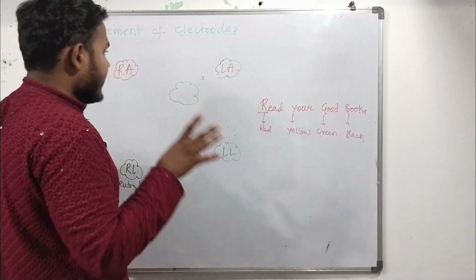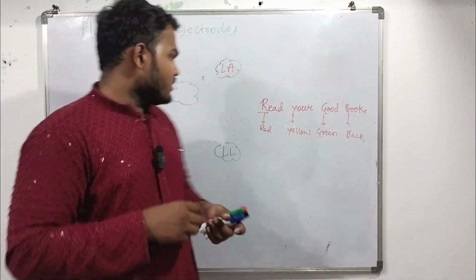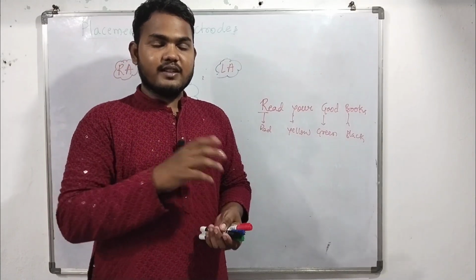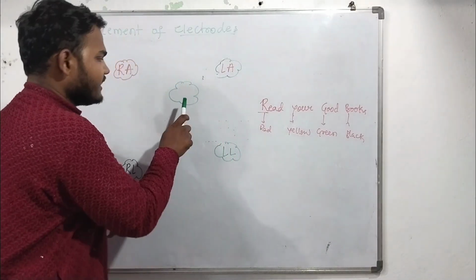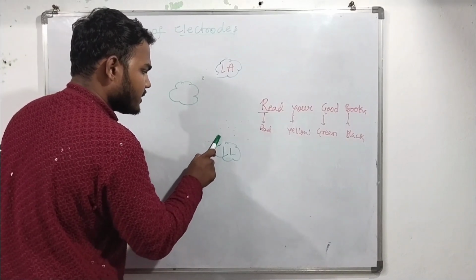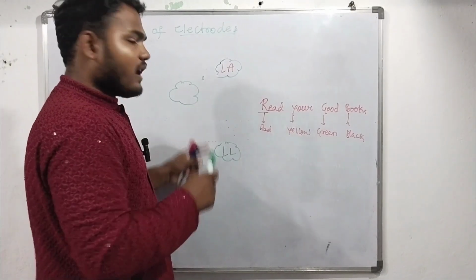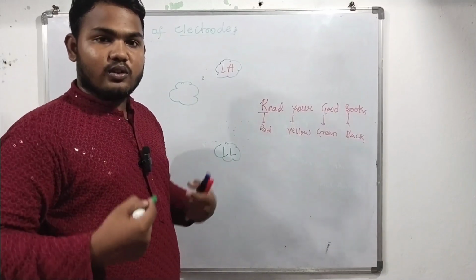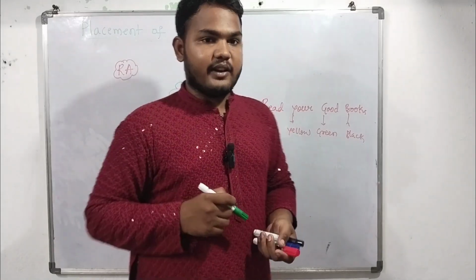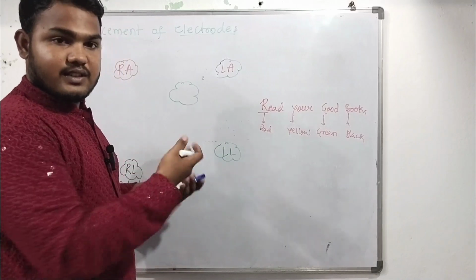Okay, it is equal, and the electrical activity does not depend upon the length, because electrical activity in the body is conducted by the volume. It means the electrical activity present here is equal to the electrical activity present here, and somewhere around the body the electrical activity is the same, because volume is a good conductor of electricity. It means the fluid which we have is a good conductor of electrical impulses or electrical activity. Okay, it means there are no distance differences here.